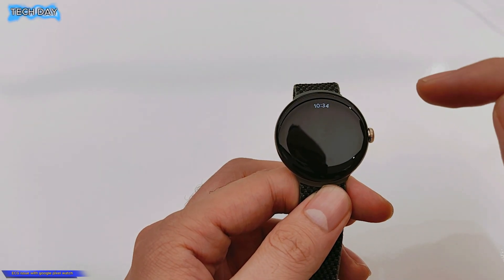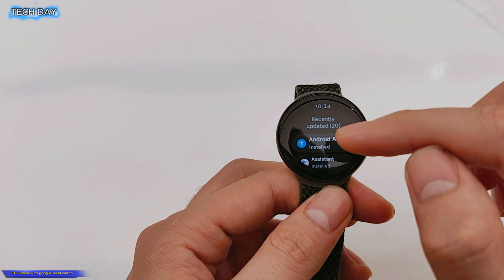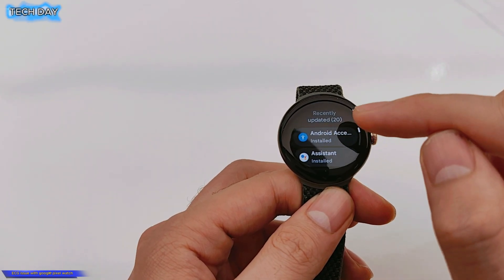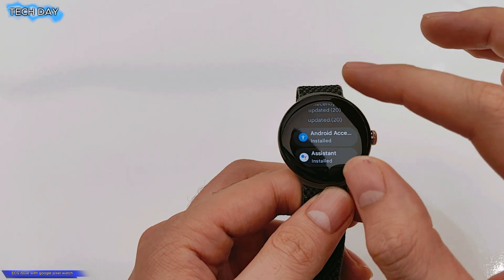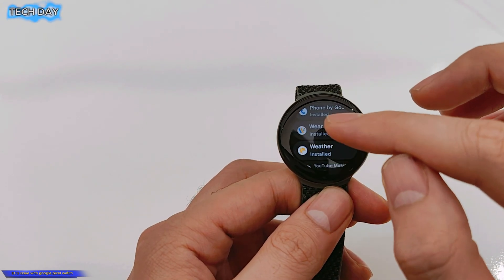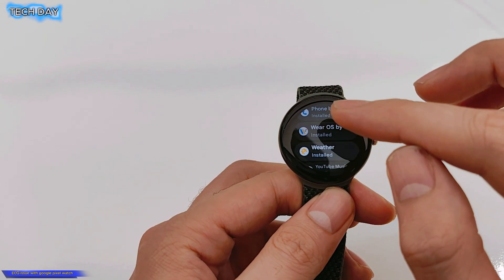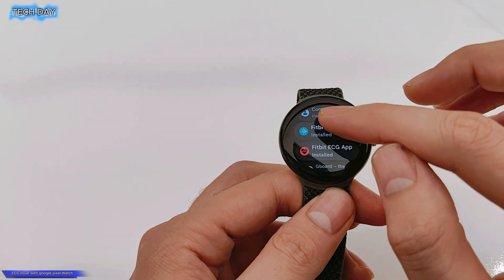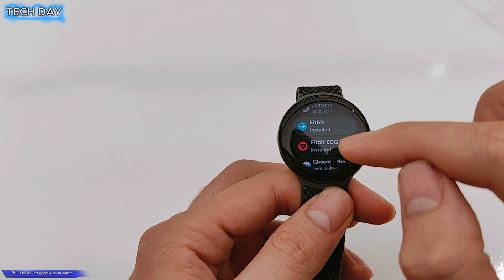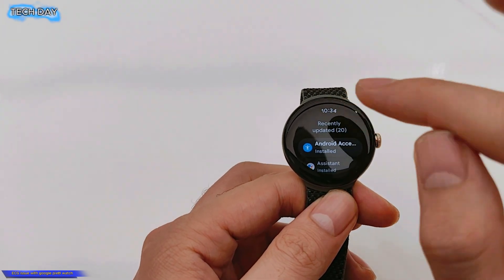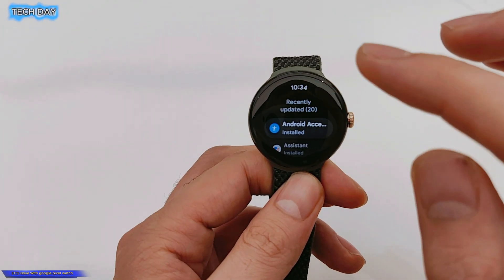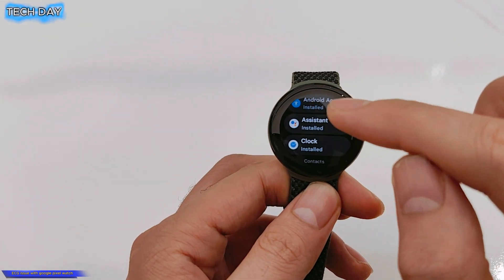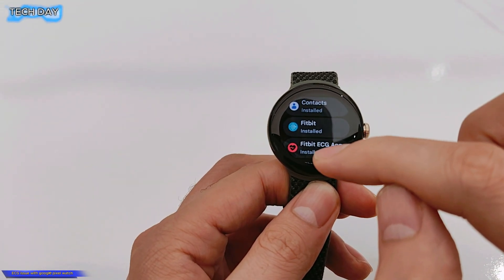Then you need to press manage apps. Okay, and here you will find the ECG Fitbit ECG, it needs to be updated. So you need to update, press update all, you will update all the applications then you will find the Fitbit ECG here installing.